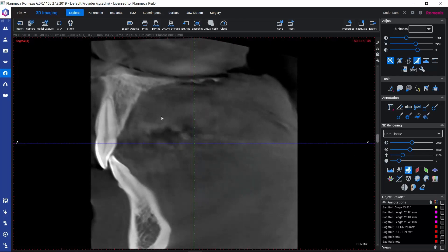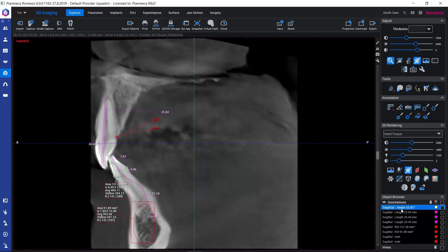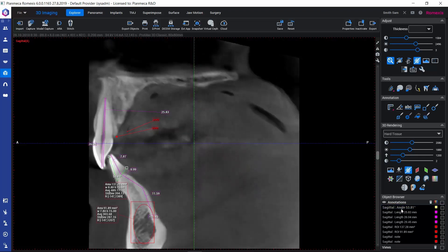We can go back to a specific annotation by clicking on it in the object browser. Clicking on it brings us back to the frame where we made that annotation or measurement.